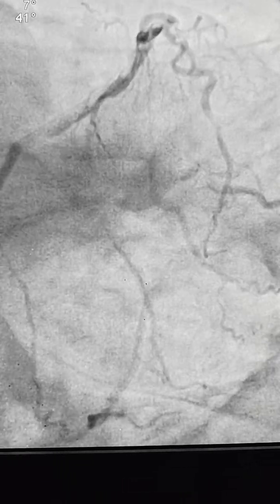There are challenges while doing angioplasty in a short left main. So we have to try different strategies. You can have a wire support in 2-3 vessels. So this was the angioplasty to the OM.